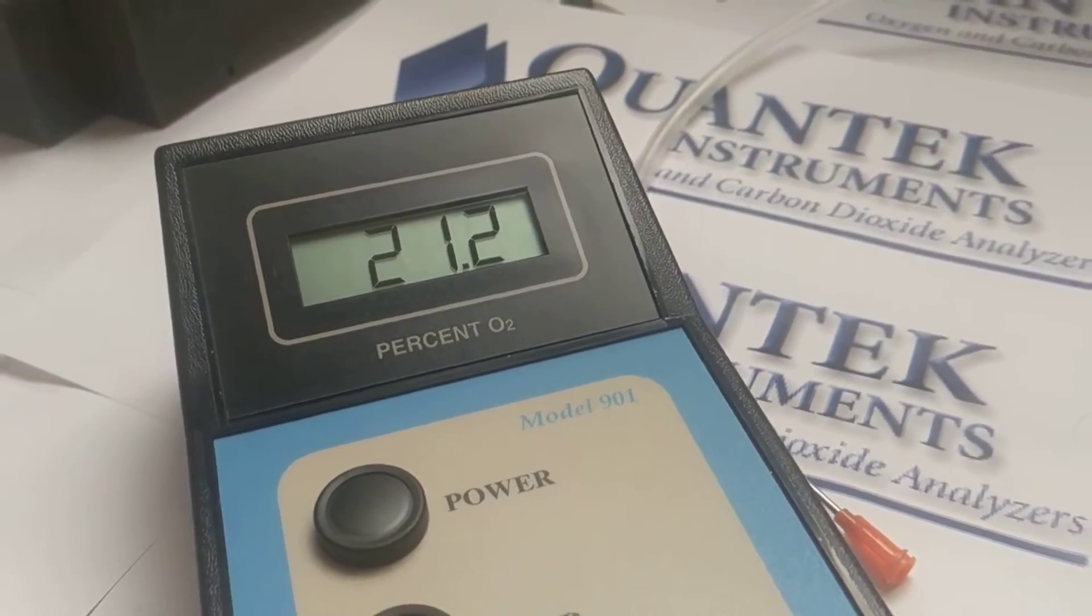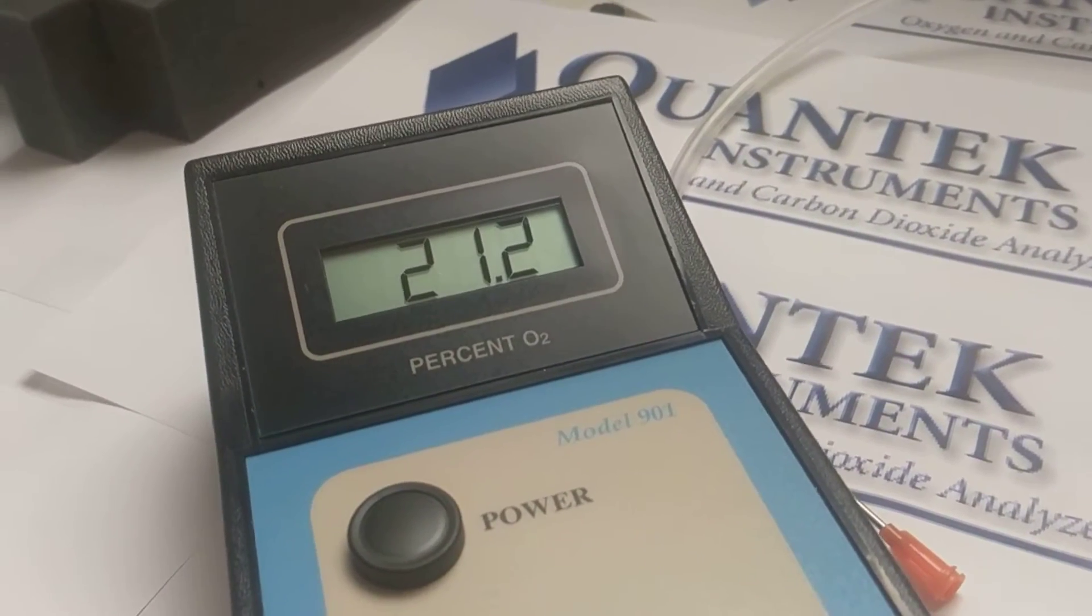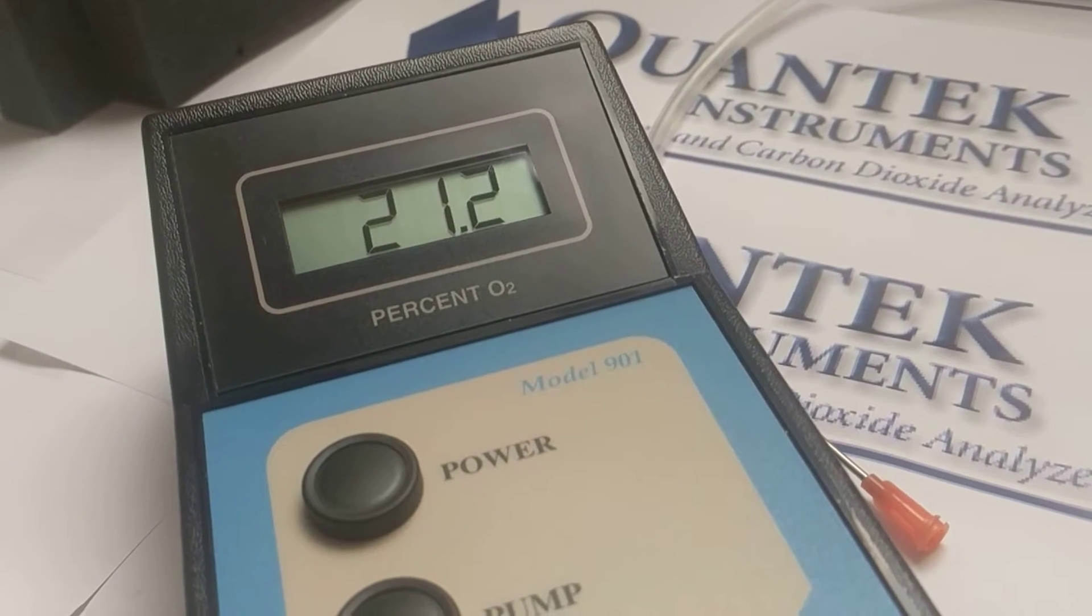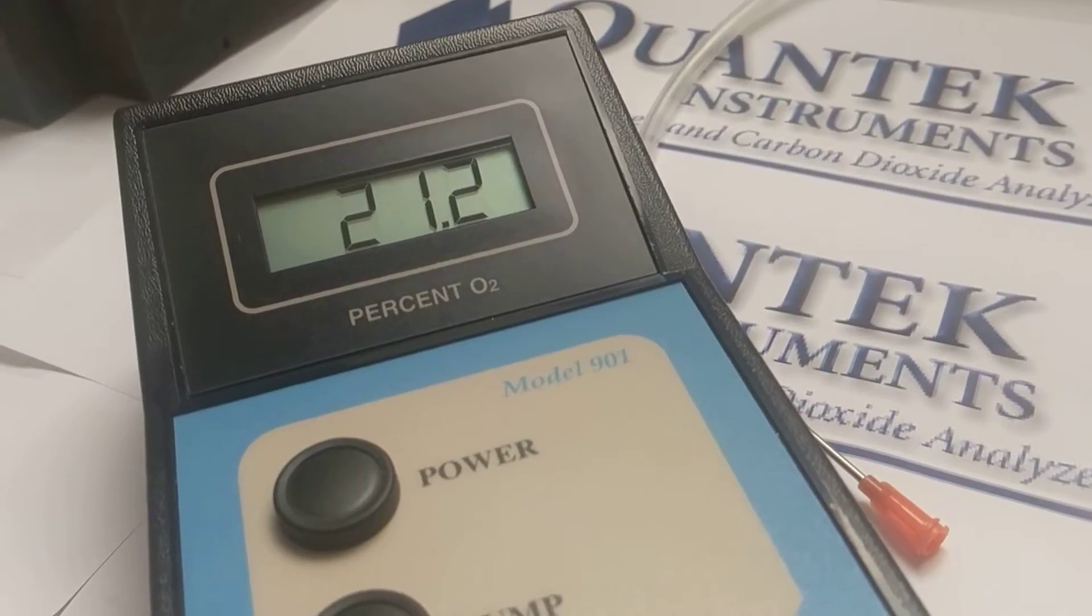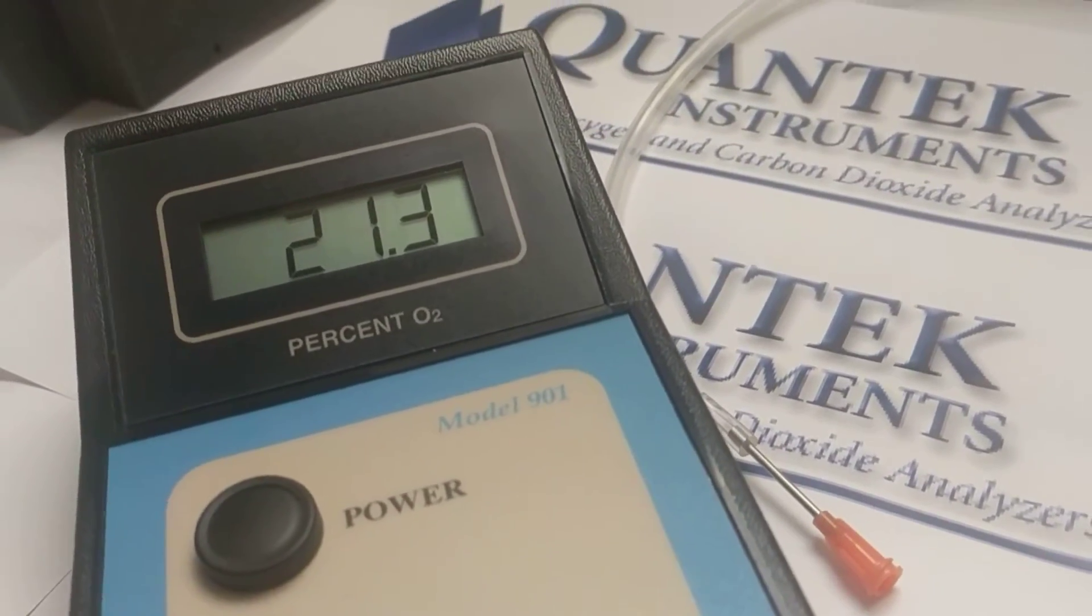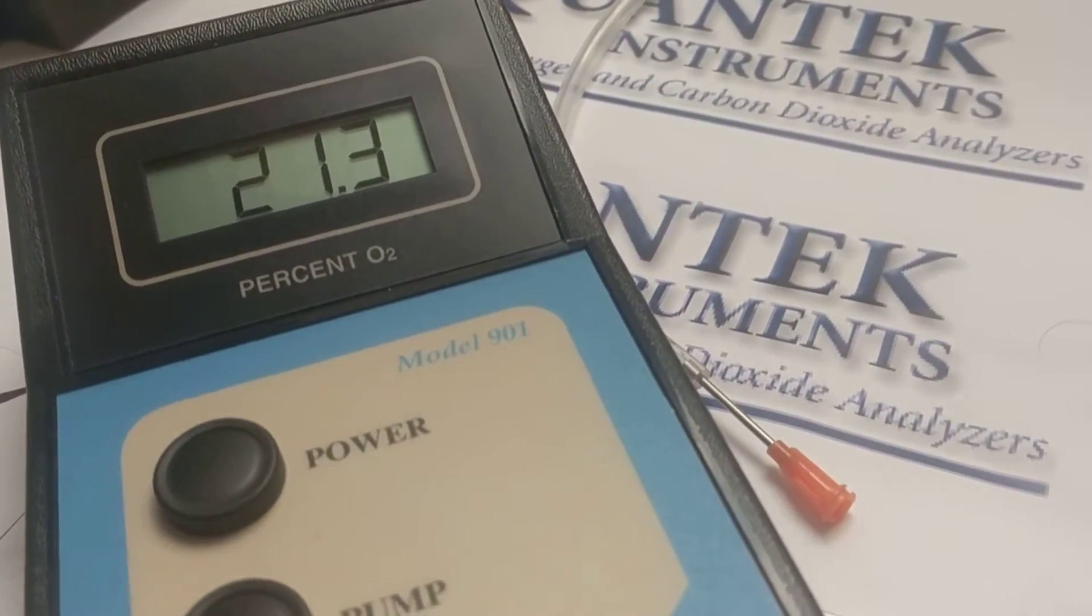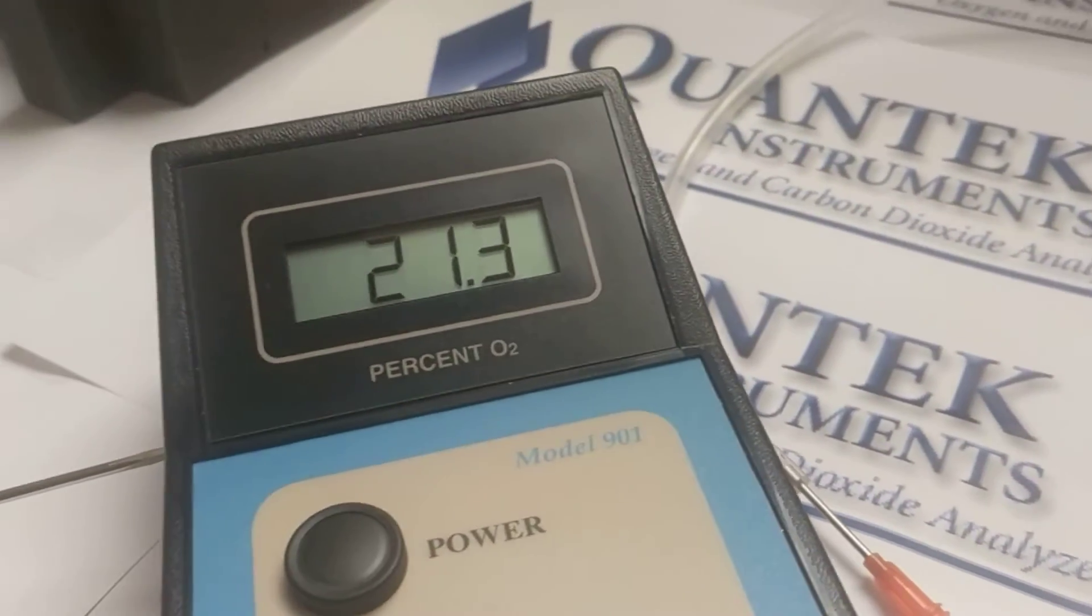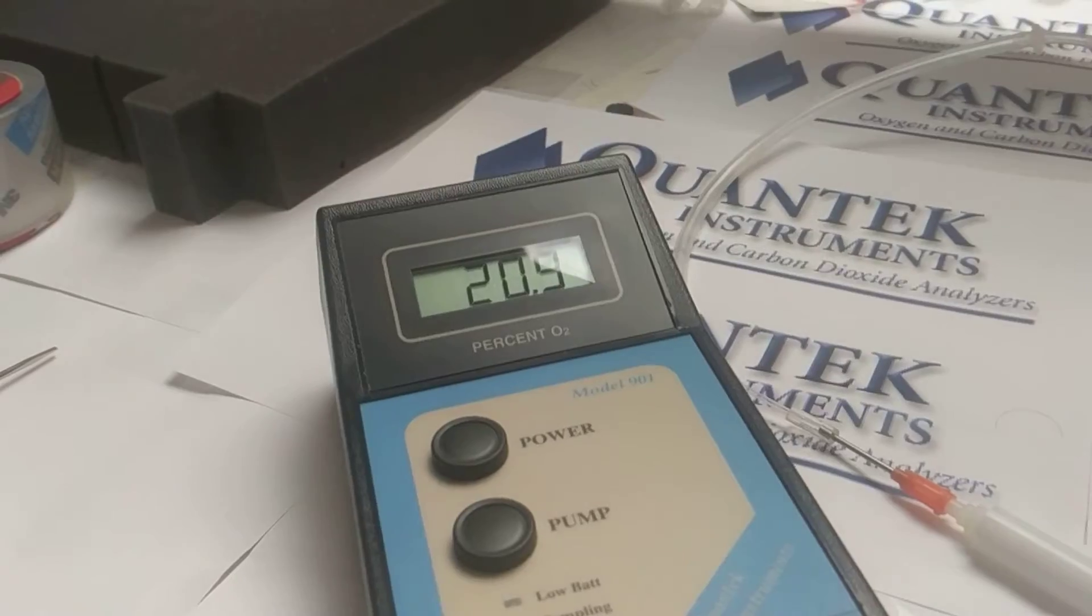We're often asked, how often should we check the O2 span? We have some customers that check it at the beginning of every day or every shift. We have some customers that check it once a month. Certainly you should make this adjustment if you change elevation, but it's really not necessary to do more than say once a month. Changes, large changes in temperature or humidity might throw this number off by about 0.1, which is statistically insignificant, especially when sampling a low level of oxygen. So now we're going to turn the span counterclockwise and adjust it back down to 20.9%.